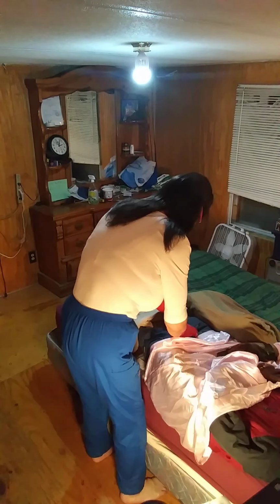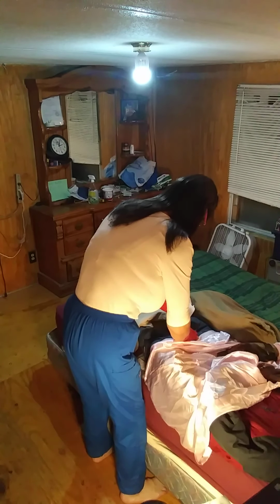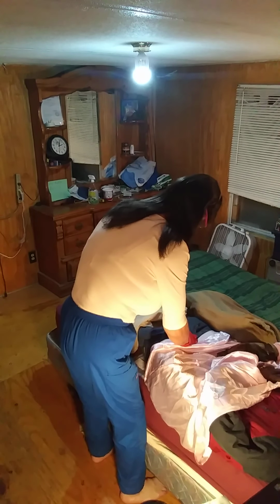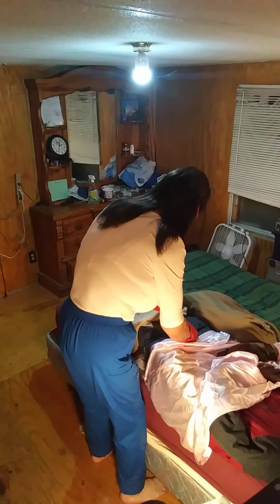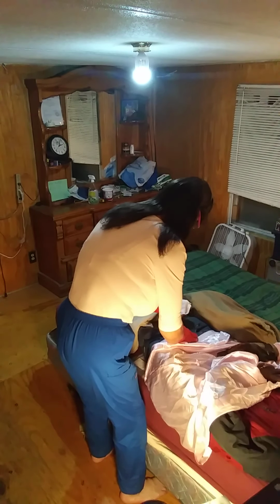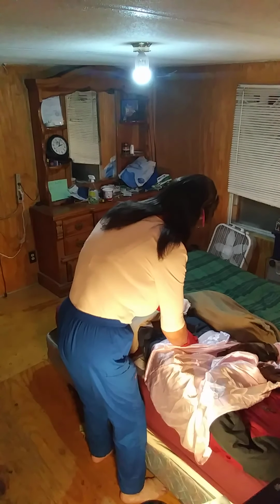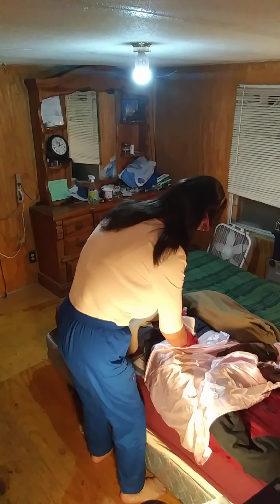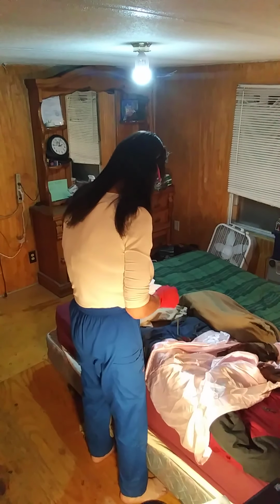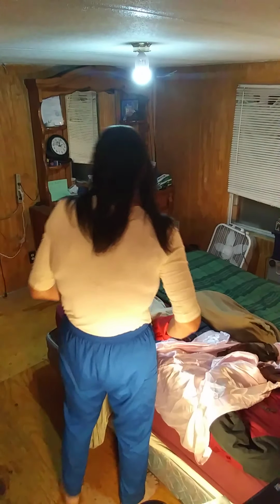Alright, I'm going to grab the catheter right above the meatus without pulling it. And I'm going to rinse it off. Once. Be very careful not to hurt Mrs. Cheswick. I don't want to pull on this. Twice. And then we'll throw this in the soiled linens.